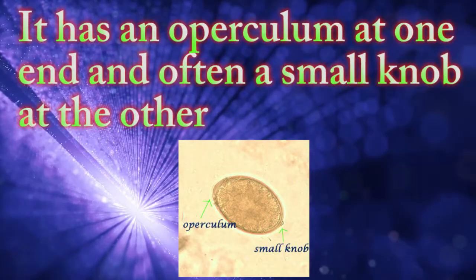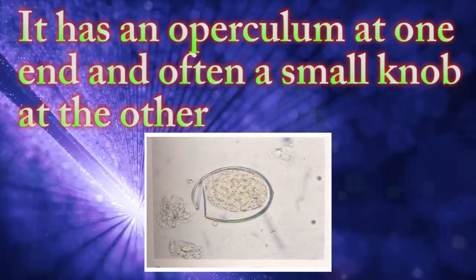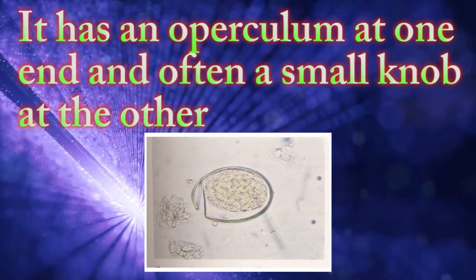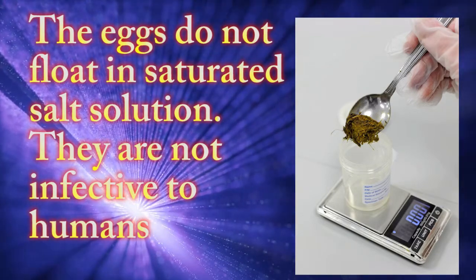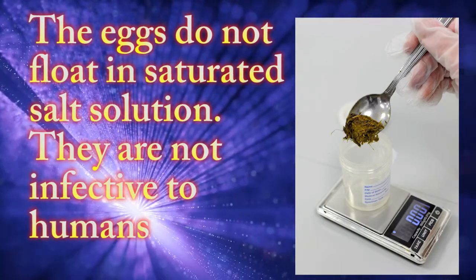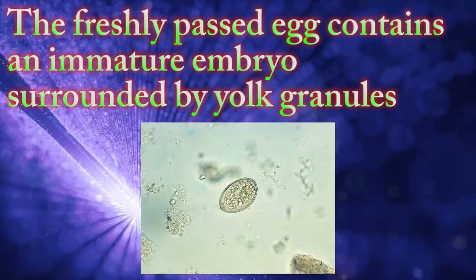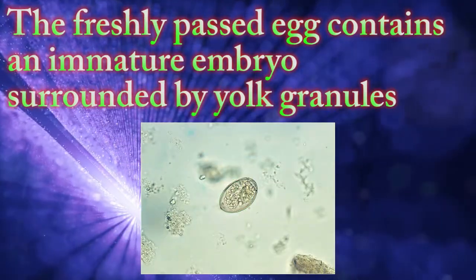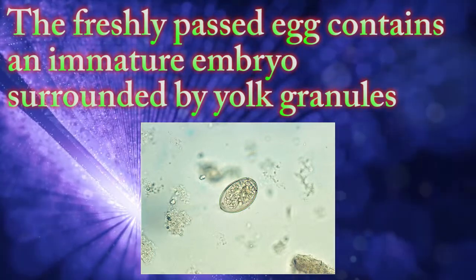It has an operculum at one end and often a small knob at the other. The eggs do not float in saturated salt solution. They are not infective to humans. The freshly passed egg contains an immature embryo surrounded by yolk granules.